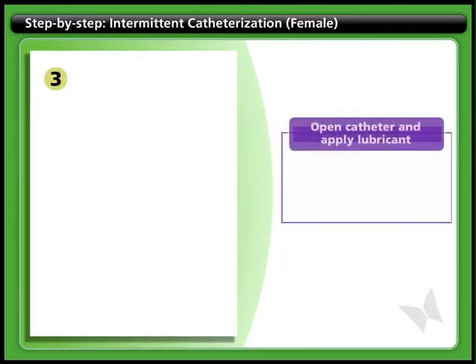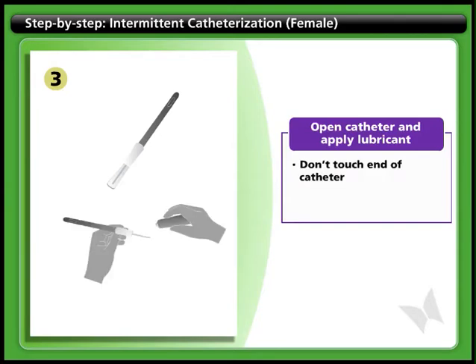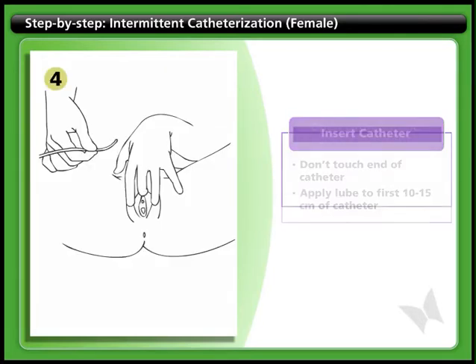Step 3: Open catheter and apply lubricant. Open the catheter package and expose one end of the catheter. Be careful not to let it touch any surrounding items or surfaces. Apply lubricant to the first 5 centimeters of the catheter.